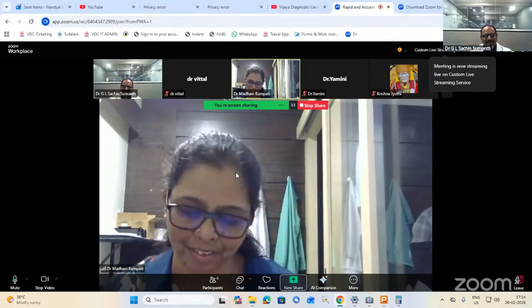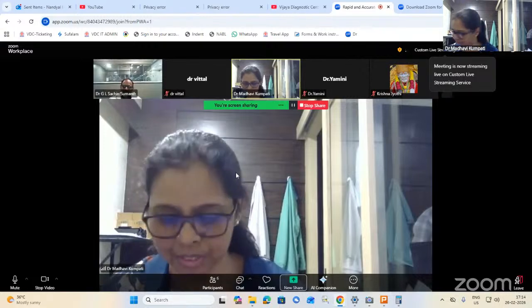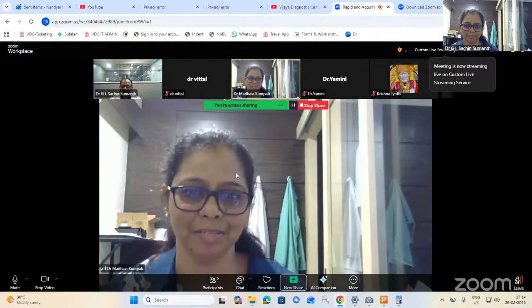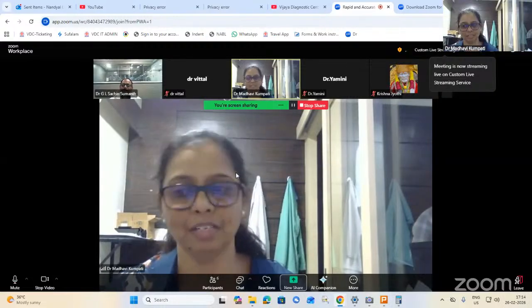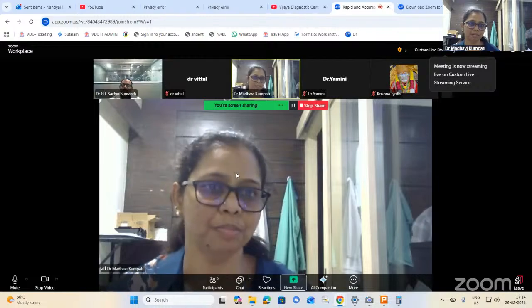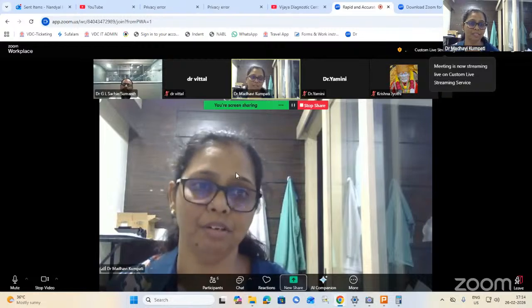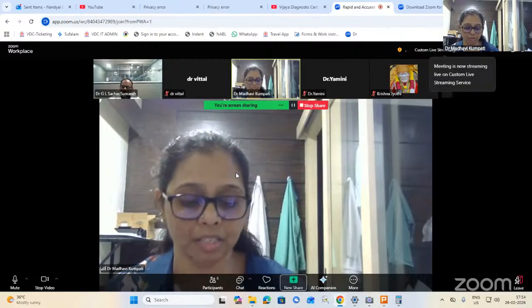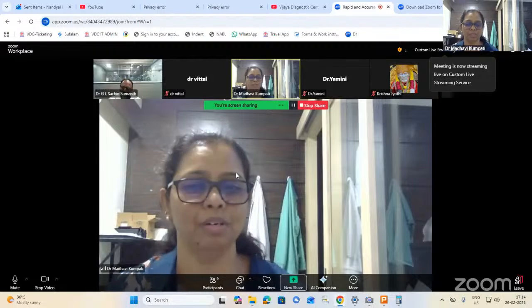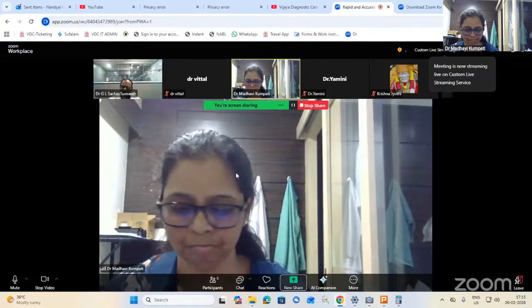I definitely agree with you. And I think the other challenge that we have is definitely with the sputum samples, because sputum samples have salivary contamination. We tell the patient how the sample has to be collected, but somehow many of the sputum samples that we receive are saliva. Unfortunately, especially when it comes to recovery of acid fast bacilli, or even a simple stain, it's really very difficult for us to report on a sputum sample with salivary contamination. It's mostly saliva that we receive. So these are the challenges that we face.